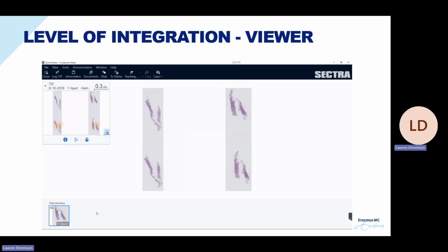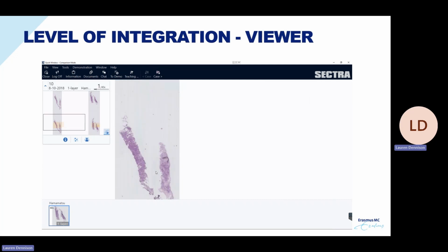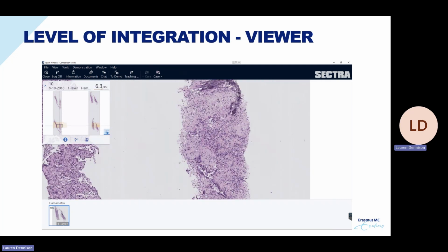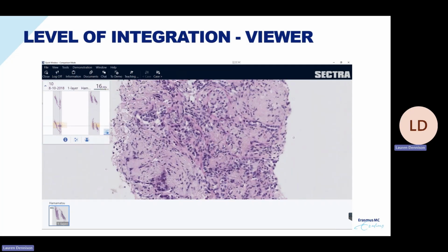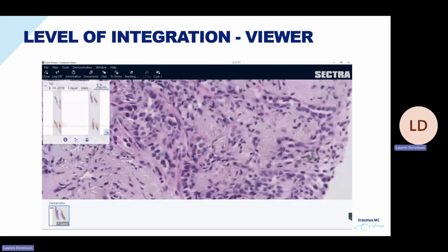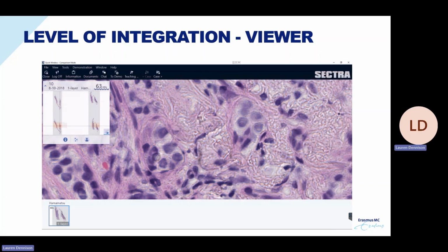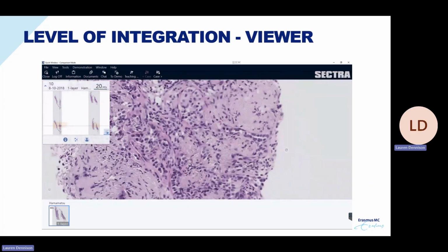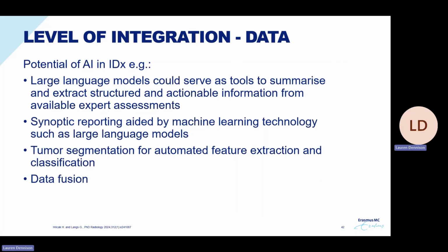So the radiologist can read up on this, and then if they want to, they can have a look at the slides. Not sure that always helps, but I think that is at least a capability that can be there, and the other way around as well, of course. And then eventually you compile your report and you classify accordingly, and potentially also resolve one of the discordances.